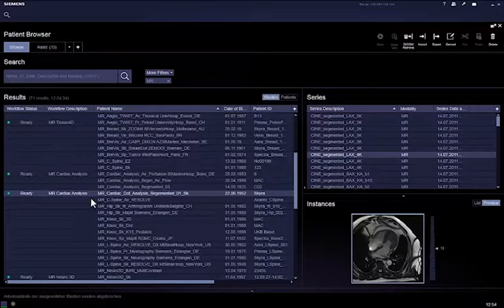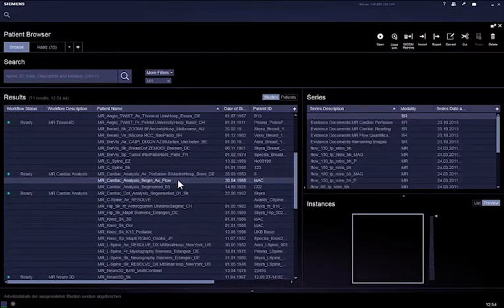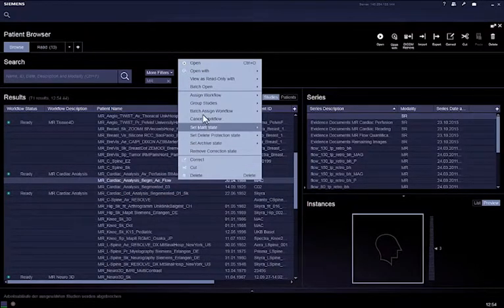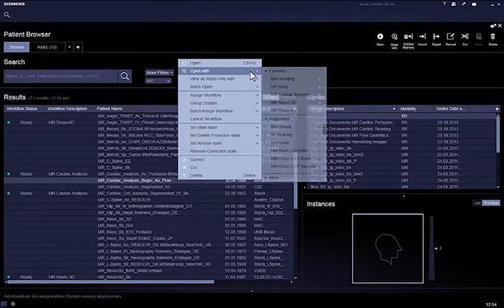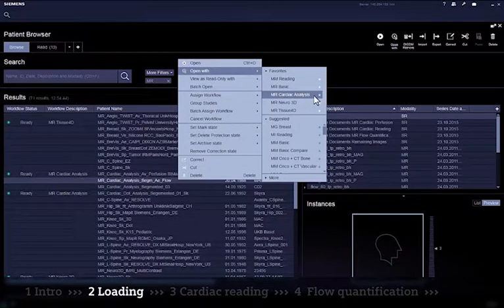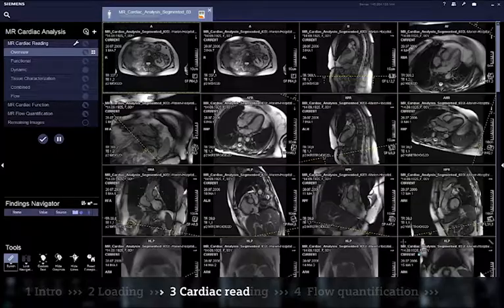Alternatively, you can manually assign the patient to the MR cardiac analysis workflow by right mouse clicking on the patient and selecting open with and choose the appropriate workflow MR cardiac analysis. This will assign the study to the workflow and automatically open the study.